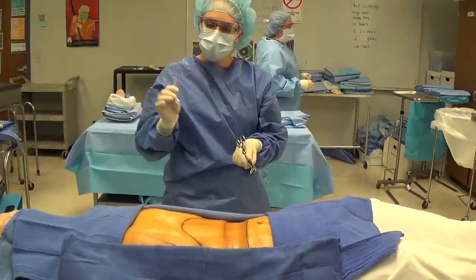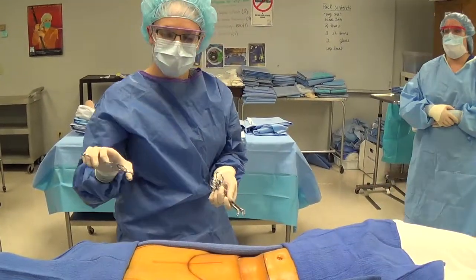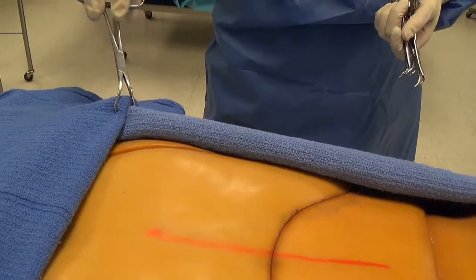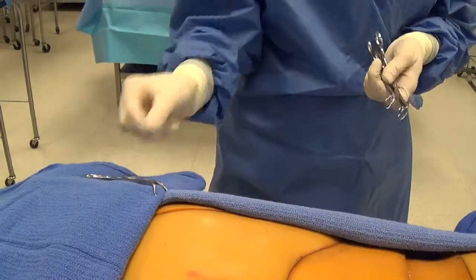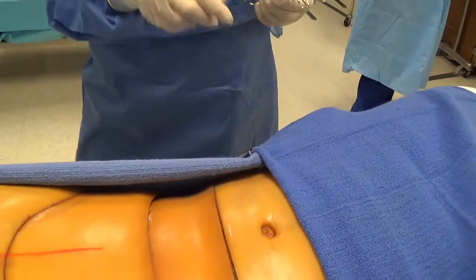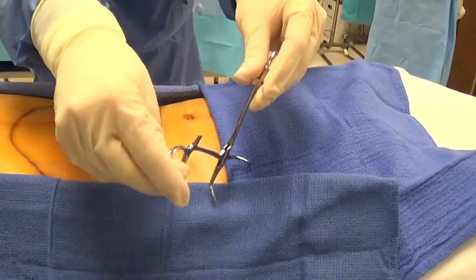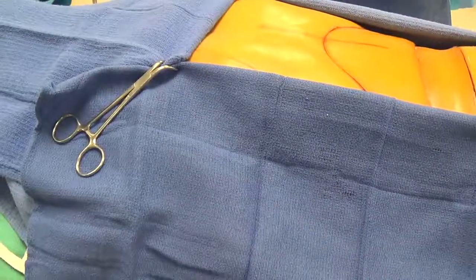Some surgeons place perforating towel clips at the corners of their linen towels. If doing so, catch the edges of the towel and lift it up so you don't catch the patient's skin, then clip the towel. Make sure the clip is not up in the incisional area — it should be pointed outward. At the end when removing drapes, don't throw these clips in the trash. Lift up and clip each corner, and on the last one lift both towels and secure them to help prevent towels from sliding down the sides of the patient.